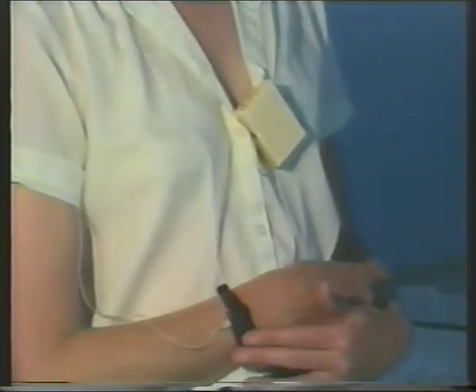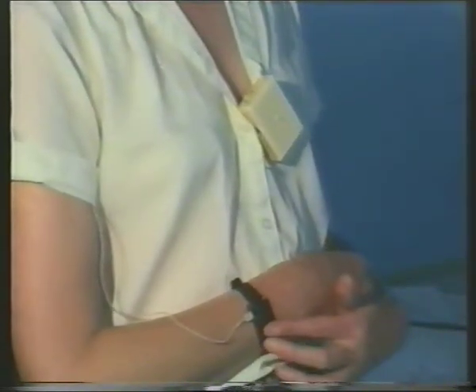There are a range of other devices designed to help people who are severely or profoundly deaf. These include the radio hearing aid, which helps the person hear voices over distance and in background noise, and various vibrating devices which can inform the person of sounds. Vibrating devices are also useful for people who've combined hearing and visual loss.